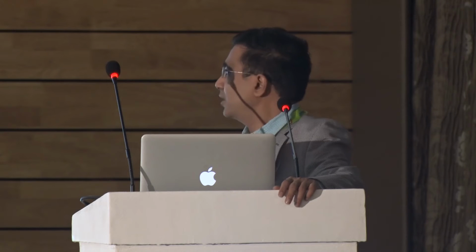These are the post-operative follow-ups. This one is a second case, a 65-year-old female, presented with pain, redness, and watering in the left eye, other eye pseudophakic. IOP on presentation was high, diagnosed as phacolytic glaucoma. And here comes the case. She has a calcified anterior capsule.